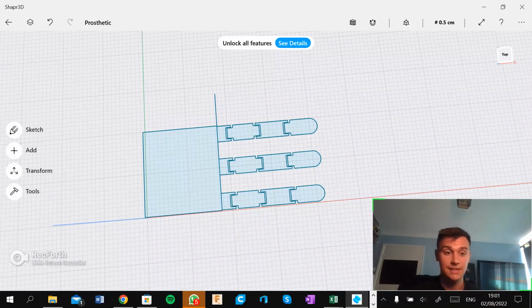And so yeah, this is it so far, and in the next one I'll be shooting it out a little bit more and just seeing where it goes from there. I'll still be basing it off my hand a little bit to start off with, maybe a little bit thicker. And then once I've got all the hinges sorted and the thumb sorted, that's when I'm going to start brainstorming some different ideas for either a motorization or more of a hinge joint on the arm. So when the arm is extended, relaxed, then that's when the hand will clasp. But see how it goes.